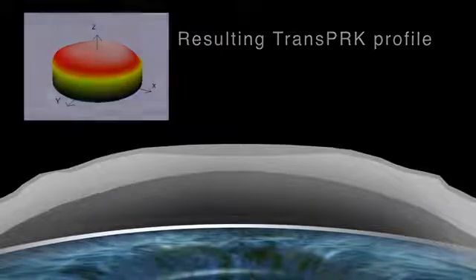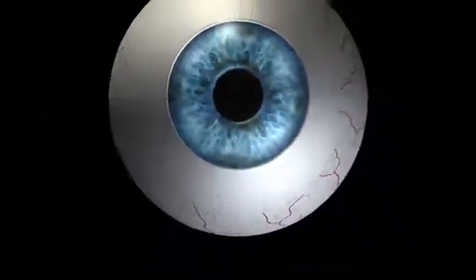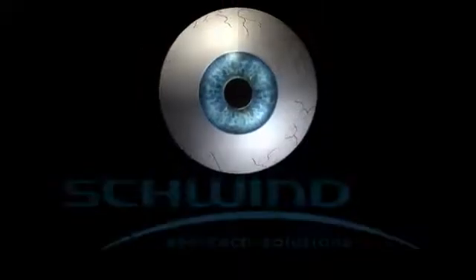Using Amaris TransPRK ablation profiles shortens the overall treatment time, minimizes the risk of corneal dehydration, and speeds up the healing process.